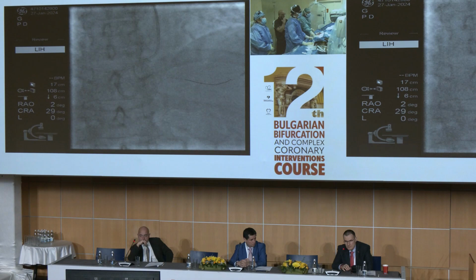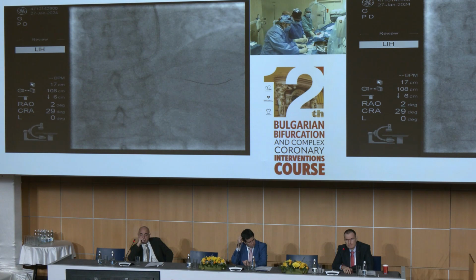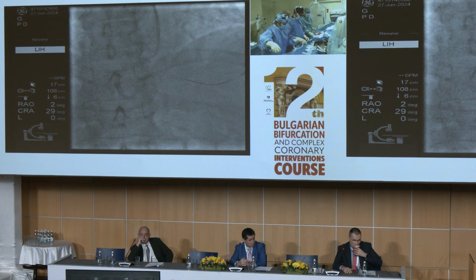We just want to be sure that it is closed, with an Export catheter till there, distal. I don't think that we have strength through the previously implanted stent that we covered with 2 long stents. So I prefer to just do a small dilation with a 1.5 balloon and just seal. 1.5, 15? 1.5, 15. Yeah, good.